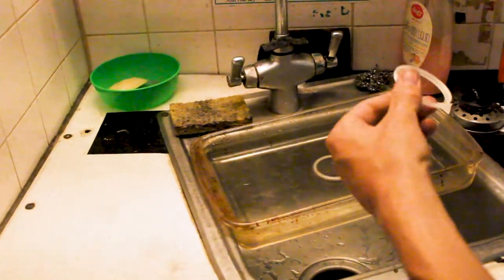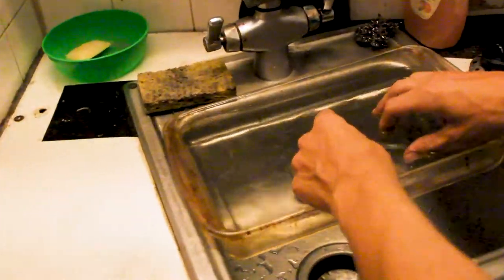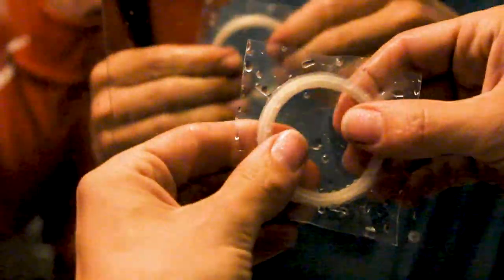And now I'm gonna take this guy. Careful not to have any air bubbles. I'm not going to do any weird clamping stuff because that sounds really difficult. Might make it way better, but we'll see. So I'm just going to get it on there, go all the way around. Cool. Before I pull it out, I'm making sure it's all perfectly squished down. Seems legit. Okay, we got some sort of lens.